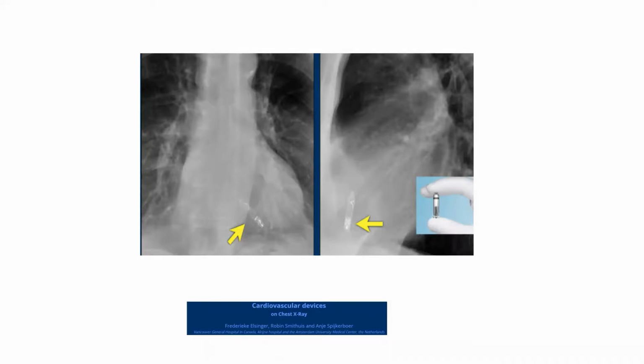Good. So I told you that there are some devices, or they are working on a device which is equipped with software, so it can interrogate the atrial ECG or the atrial electrical activity and synchronize the pacing with it. So it's kind of advanced software. And in this case, it might work like a dual chamber pacemaker. So the technology is advancing, the technology is going on. So probably the leadless wireless pacemaker might take over the field of pacemakers.